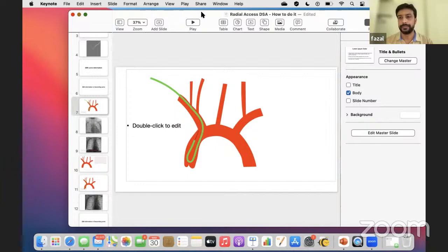Okay. Red 62 goes through 7F Fubuki also, right, sir? Yeah, it goes through that. And they were also using a Zoom 64 or Zoom 58, 55 something. Okay. There is a Zoom 55, Zoom 71. There is a catheter in between that, I think. So they were using either that or a Zoom 55, and they were having very good results. These are cases who get TPA, 85-year-old, 90-year-old cases.